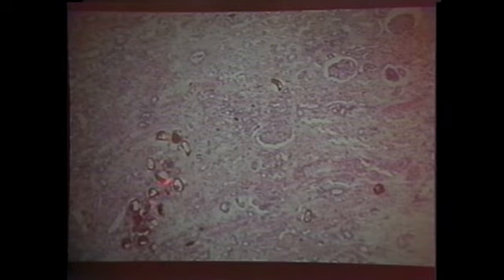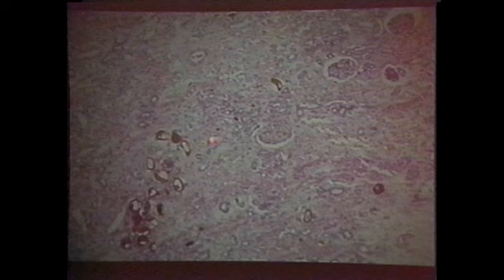But if you have an unknown animal that has an unknown one of these things, you really can't go more than trematode. Here we go, a schistosome in a blood vessel. Most people think that all schistosomes have either terminal or lateral spines like Schistosoma mansoni here. But in fact, there are so many other types of schistosomes in the world. This is a turtle schistosome, if you will.